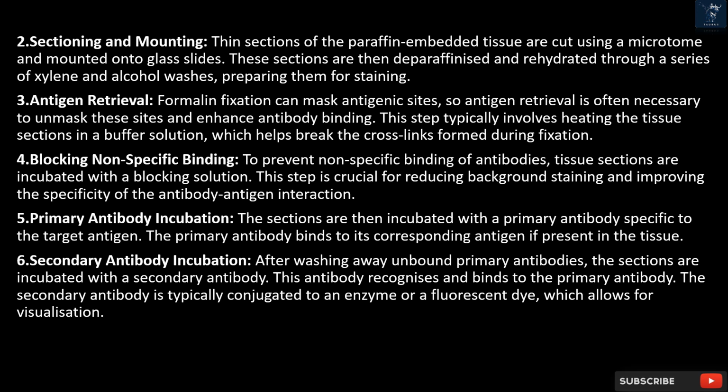Blocking nonspecific binding. To prevent nonspecific binding of antibodies, tissue sections are incubated with a blocking solution. This step is crucial for reducing background staining and improving the specificity of the antibody-antigen interaction. Primary antibody incubation. The sections are then incubated with a primary antibody specific to the target antigen. The primary antibody binds to its corresponding antigen if present in the tissue.